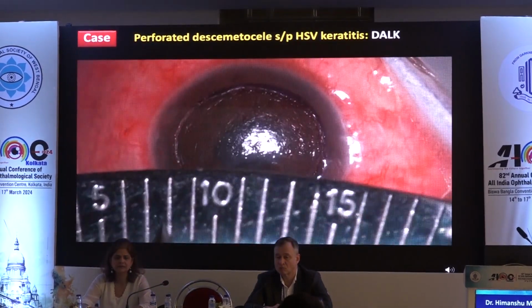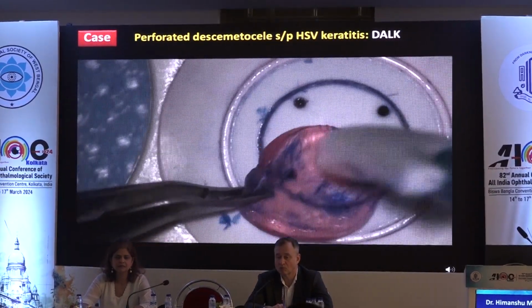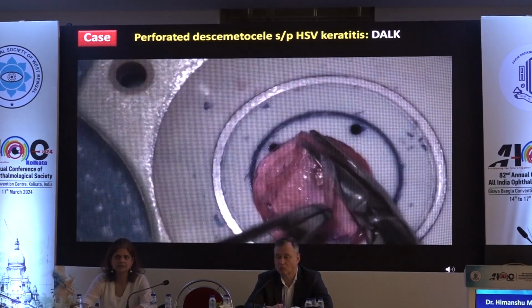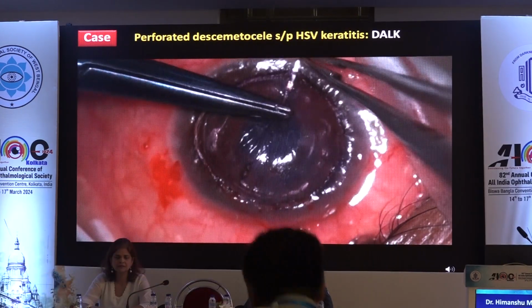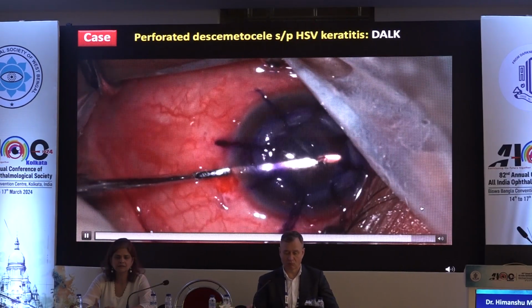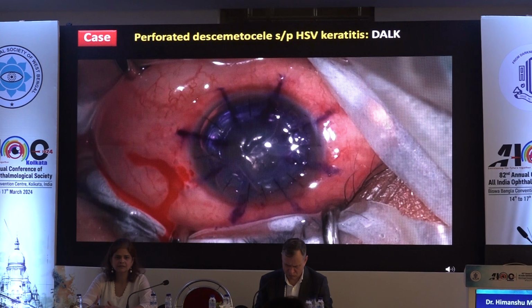there. I did not try to bare the Descemet's membrane there. Basically, you want to do a deep DALK there, and as the residual bed was not deep enough, I had to thin out the donor cornea there. The surgery was good enough, and then after putting 8 sutures, I put an air bubble inside and removed all the anterior synechiae, whatever was there.